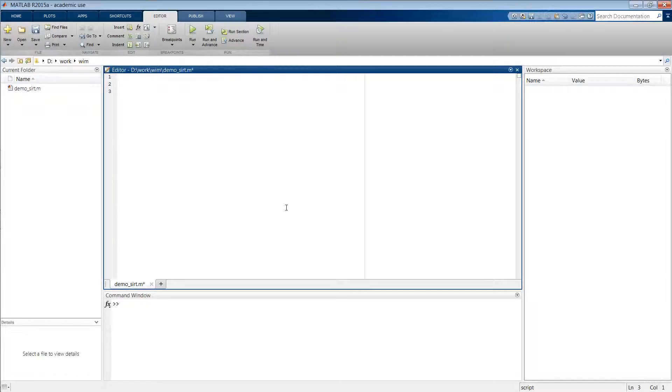So let me first create our phantom image. We want to create a 512 by 512 Shepp-Logan phantom, and the first thing to do is to define the geometry.